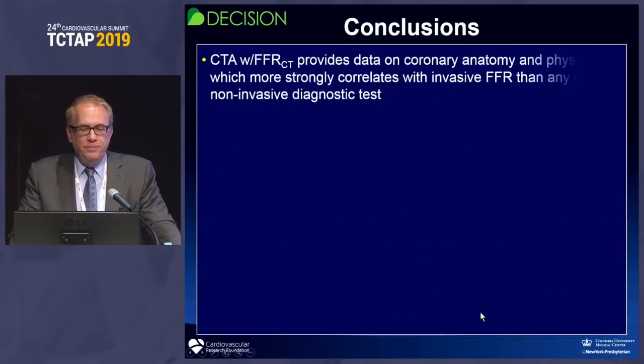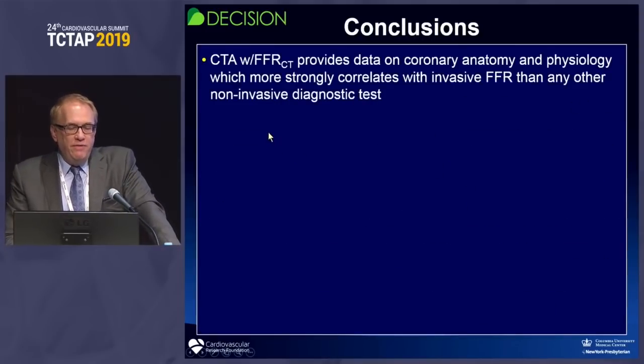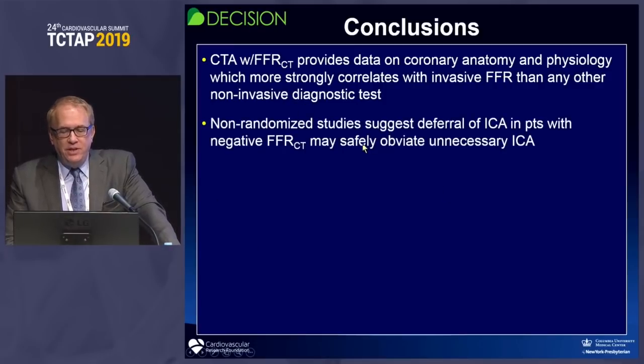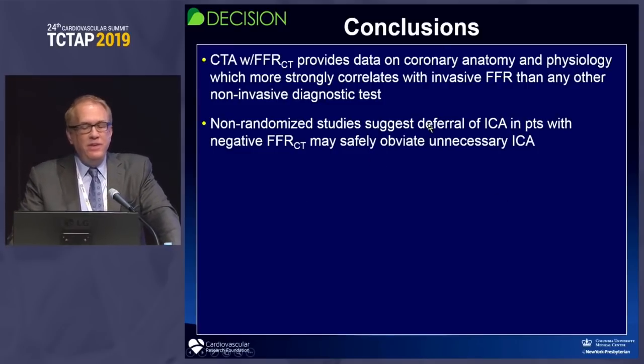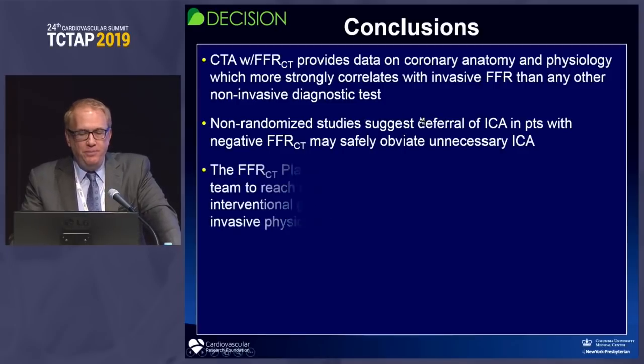So in conclusion, CT with FFRCT provides data on coronary anatomy and physiology, which more strongly correlates with invasive FFR than any other non-invasive diagnostic test. Non-randomized studies suggest that deferral of invasive coronary angiography in patients with a negative FFRCT may safely obviate unnecessary angiography.